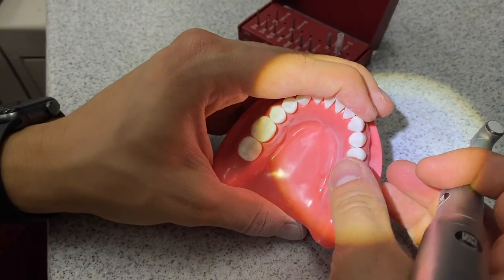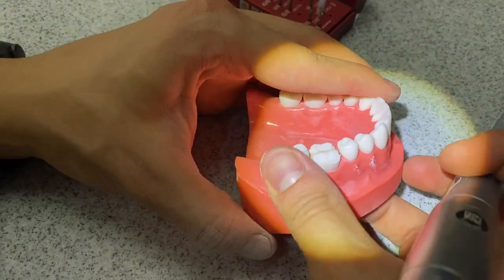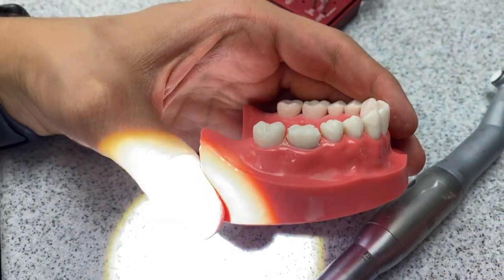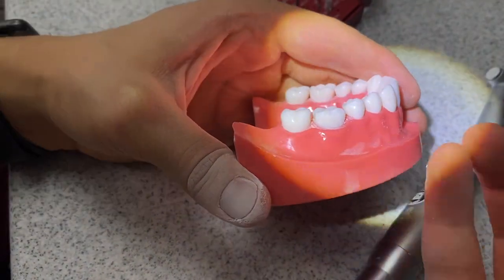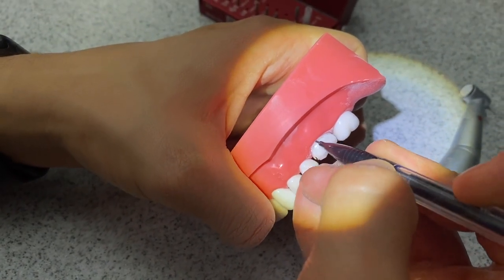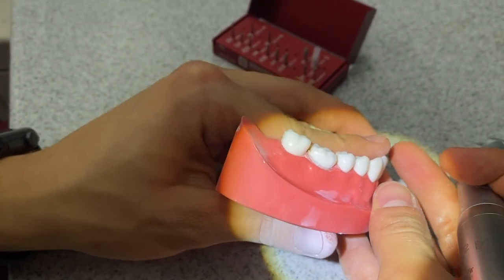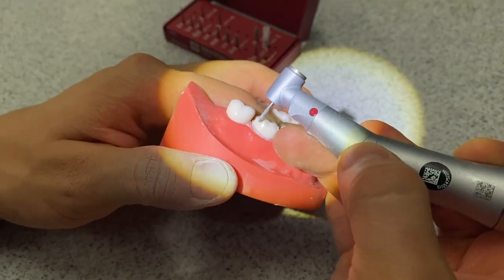You should be able to feel it and it should feel smooth. Moving on to the next portion — in my opinion, this is probably the hardest part, which is the axial reduction. After having drilled all of this, we've lost that 0.5 millimeter line I had done to prevent it from hitting the gingiva, so I'm going to redraw that. My best tip for the axial reduction would be to also make depth grooves there.